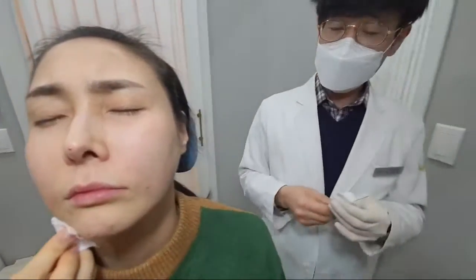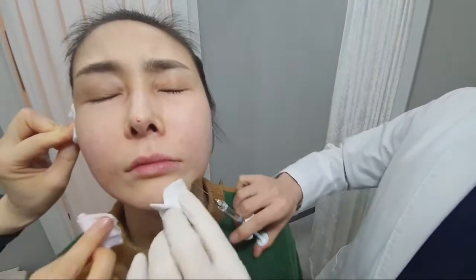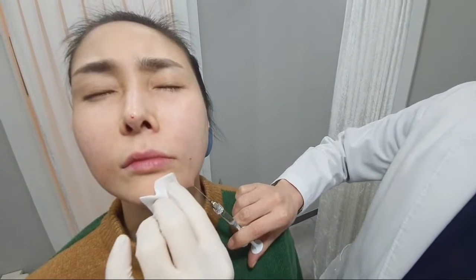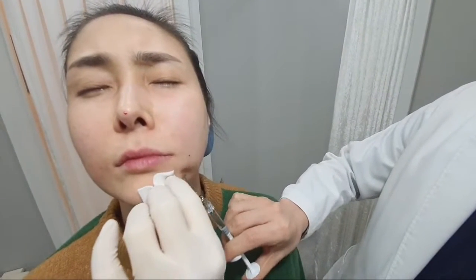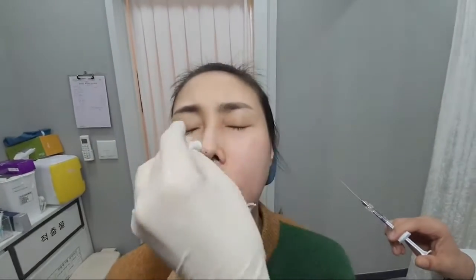Bellotero, the filler that he's working with right now, is a monophasic filler, and it goes in smoothly compared to other fillers. Personally, Dr. Ro feels that if the filler injection feels stiff, that's when a lot of medical accidents happen. So he prefers to use monophasic fillers, which go in smoother compared to others.